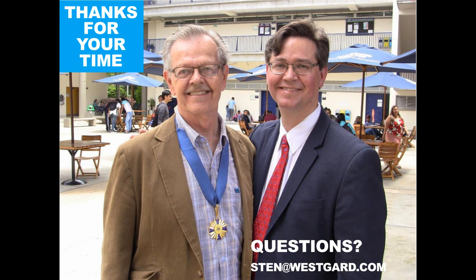Excellent. So the proficiency testing criteria of CLIA are in the Federal Register. You could type in all those terms I just mentioned on Google, and you eventually will find the list there. On the Westgard website, Westgard.com, we have a quality requirements section. We list not only the CLIA goals, we list RiliBÄK, we list RCPA.